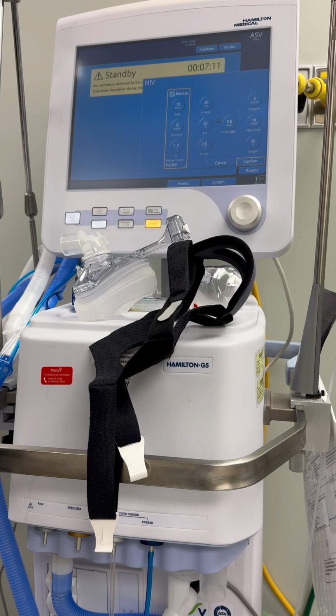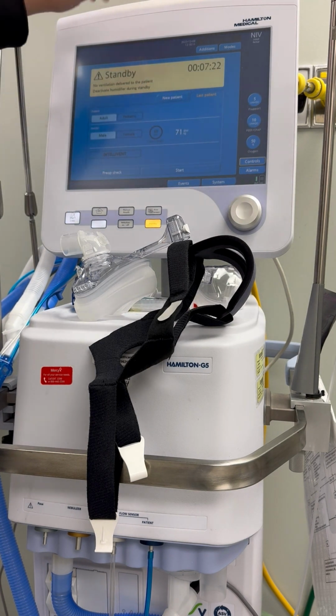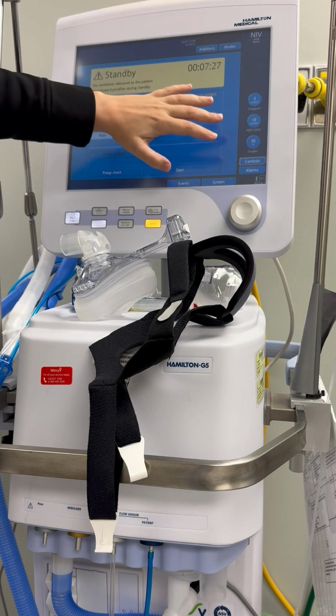If we go to NIV ST, you can actually set your backup rate, very similar to how we set up our V60s. So let's go ahead and confirm here. So right here on the top indicates you are in NIV, and then your NIV settings here.